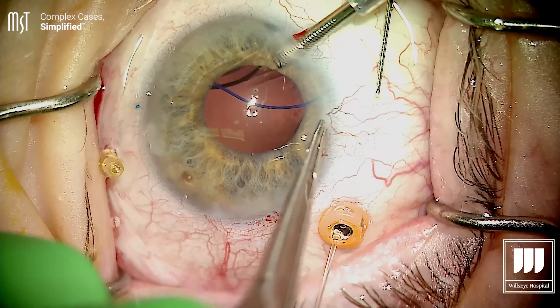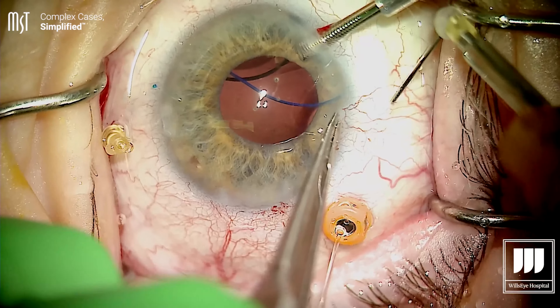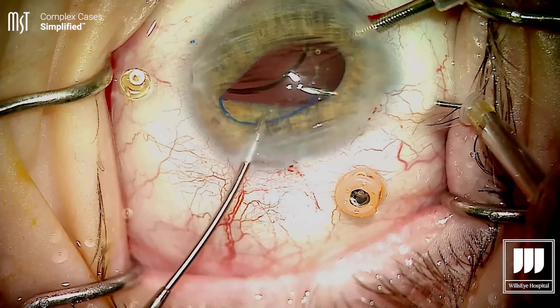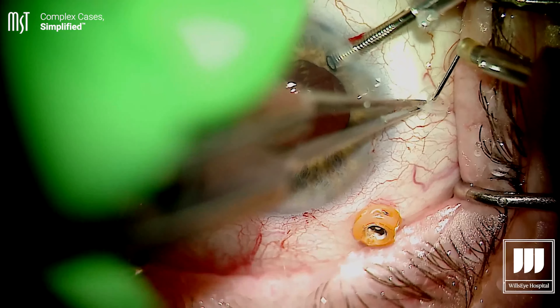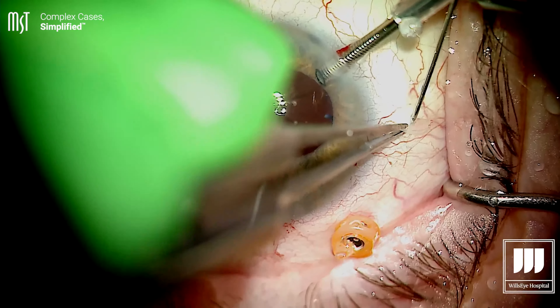It's a little bit of a leap of faith, but it'll be okay. If you move your incisions over or use a more left-handed incision, the trailing haptic becomes a bit easier. Pass your second needle and make sure the eye is always pressurized with the anterior chamber maintainer whenever you're making a sclerotomy. Make sure the angle the haptic is facing and the angle the needle is facing are the same — there's only about 50 microns of space left in that needle after the haptic fills it, so any kink or misalignment won't let the haptic slide into the lumen. Once that trailing haptic is in the needle, the job is done.